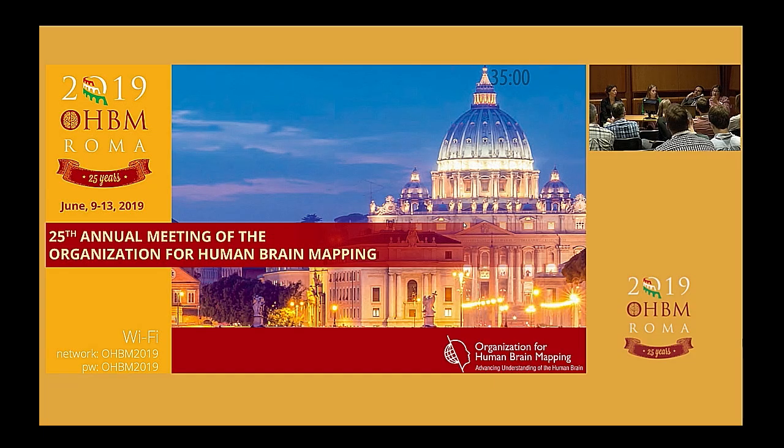And so in the piloting, I kind of like, okay, what is reasonable? That's subjective, but I was looking at a bunch of our pilot data and marking, okay, I want to censor this, I don't want to censor that. And we fiddled around with an FD threshold that we're using, and then I just fixed it. And we are keeping that FD threshold until somebody proves otherwise, so it's arbitrary, but it seemed to be the least bad way to do it.